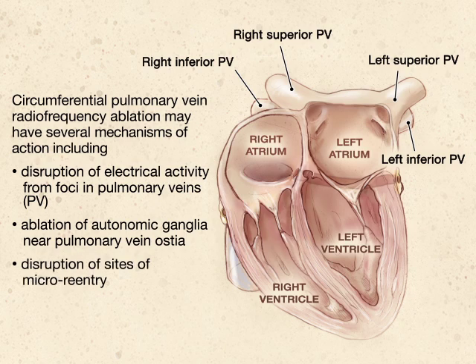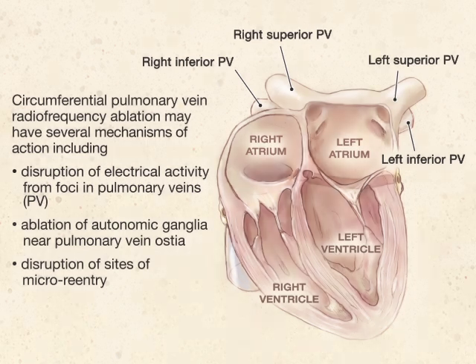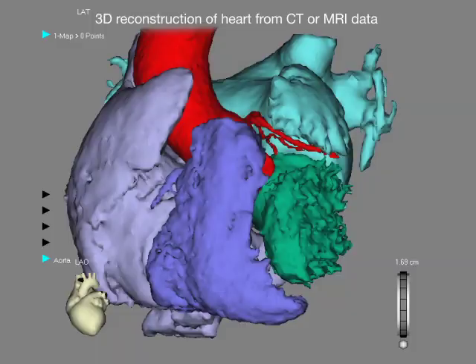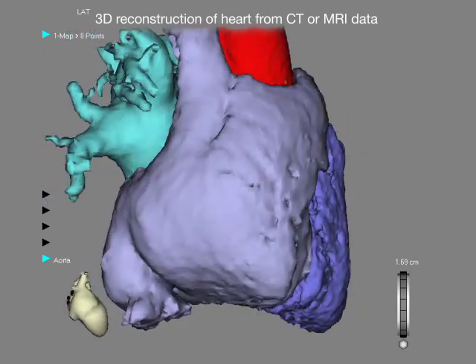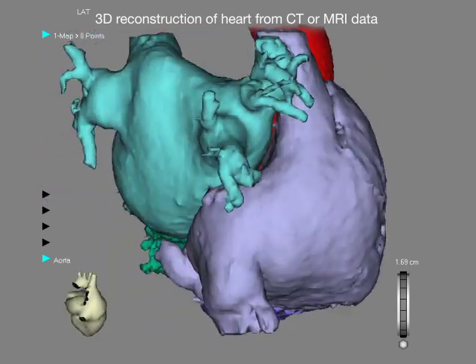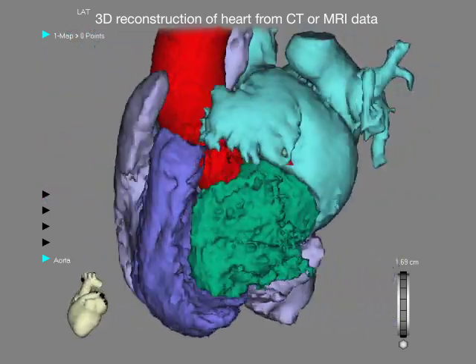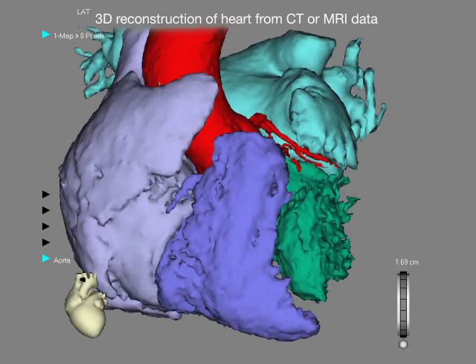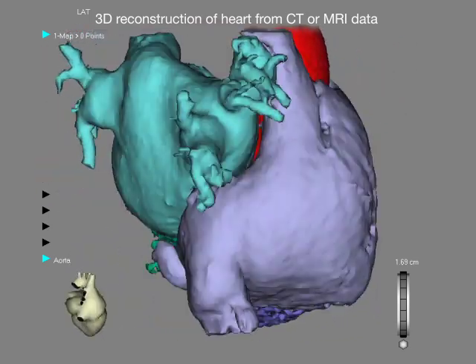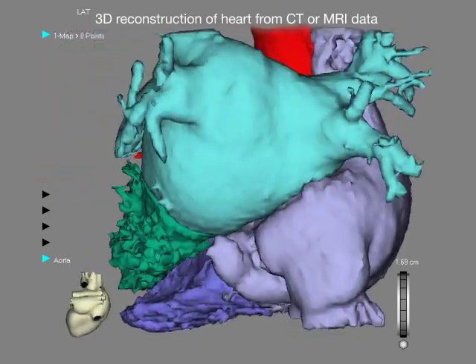Although the best results of ablation therapy are obtained in patients with paroxysmal atrial fibrillation, this strategy is also commonly used for the treatment of persistent atrial fibrillation. A three-dimensional reconstruction of the heart is generated from cardiac computed tomography or magnetic resonance imaging data using electrical anatomical mapping software.